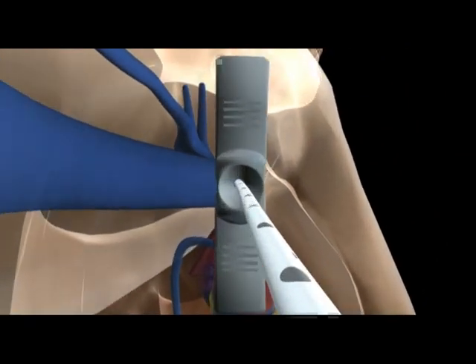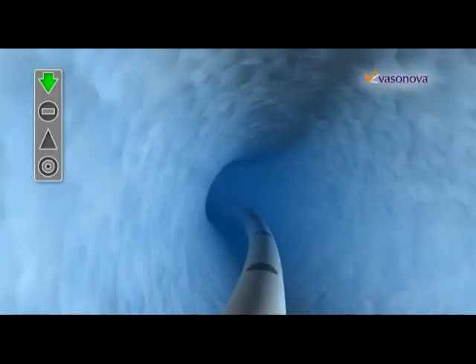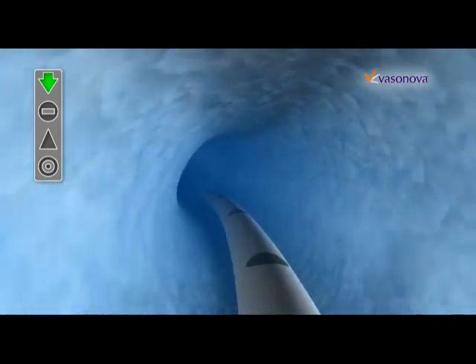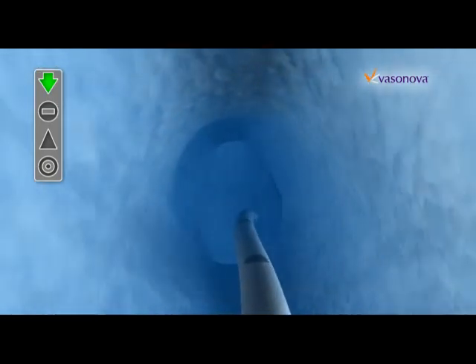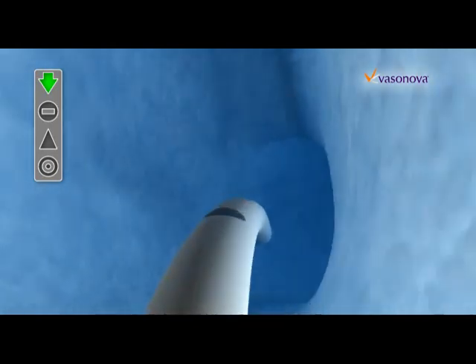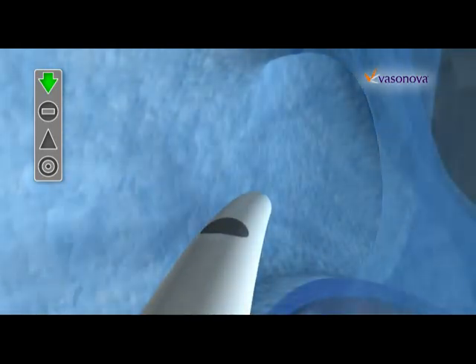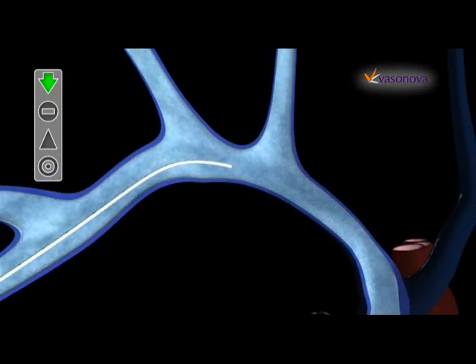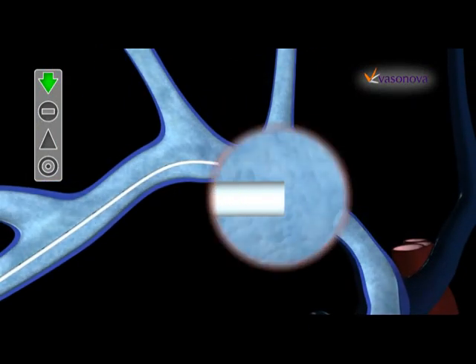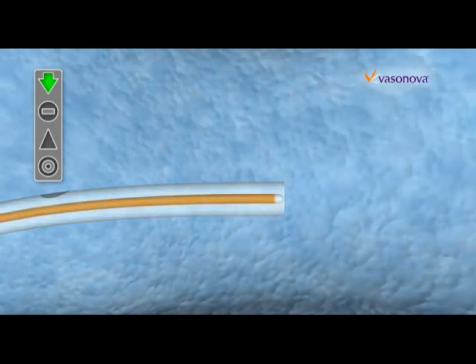Vasonova VPS technology is designed to use internal physiological information to specifically place the catheter tip in the optimal location within the vasculature. Inside the Vasonova VPS stylet is a unique combination of intravascular Doppler ultrasound and ECG signal sensing.